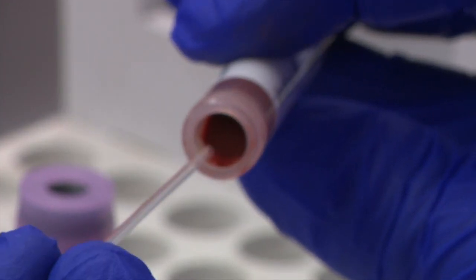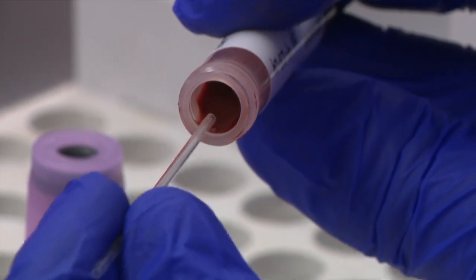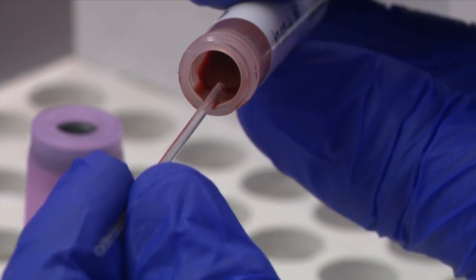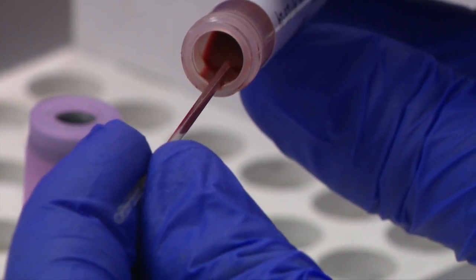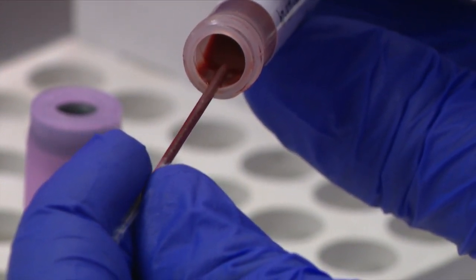Carefully tilt the vial so the sample flows to the open end of the tube. Place one end of the micro hematocrit tube in the blood and then gradually tilt the micro hematocrit tube downward until the tube is two-thirds full of blood.